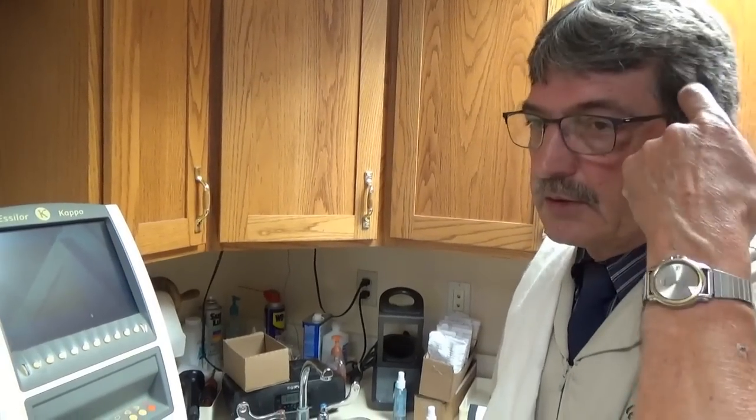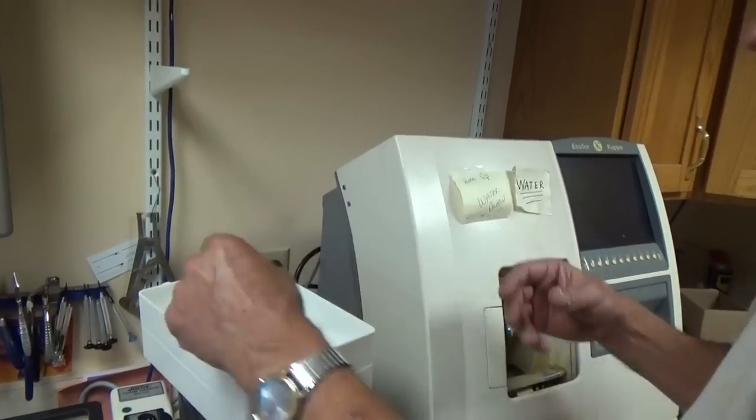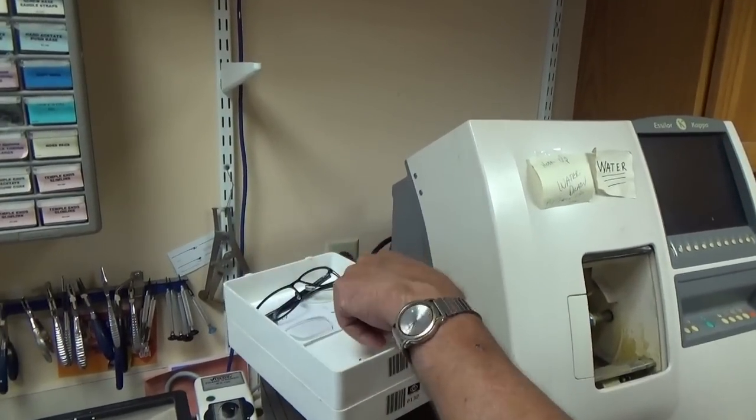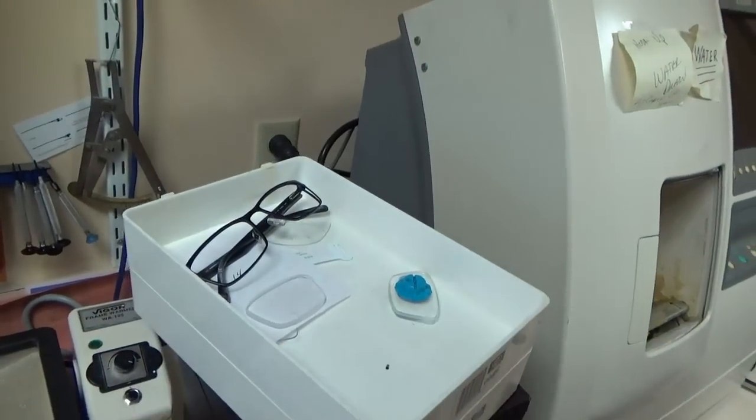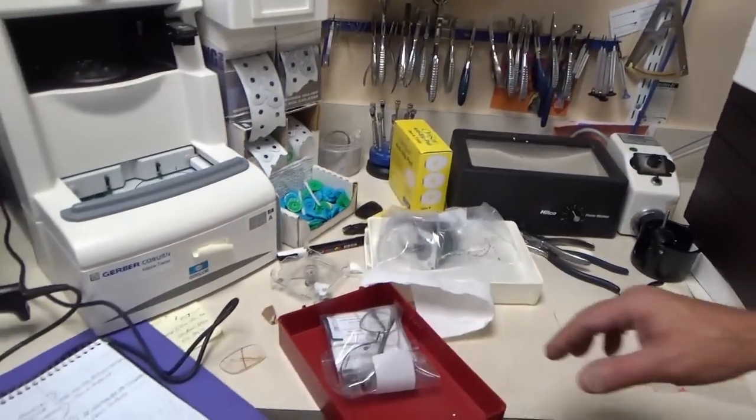Those lenses have to be made specific for the person. You send to the lab with the pupil distance, the frame measurements, the seg heights — they put that into their computer and it tells them the best way to cut the lenses so there's enough room for the frame.